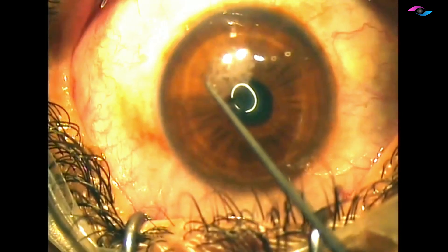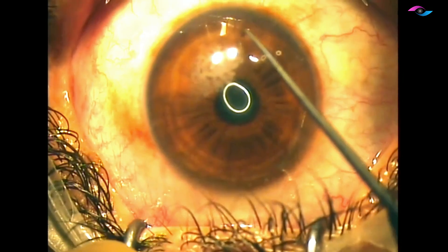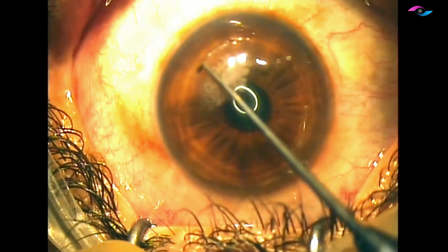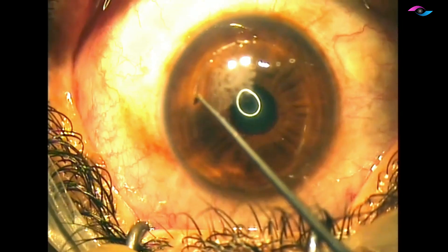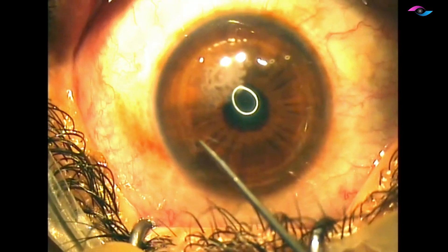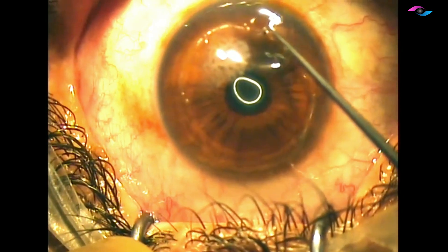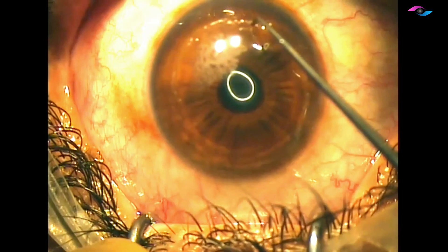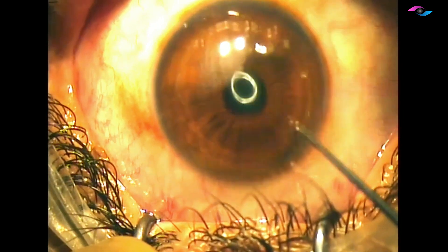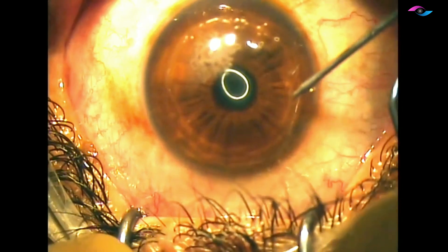We have taken him into the LASIK OR. What we are doing here is first delineating the flap which was created 15 years ago. We are making sure that we have all the flap margins, so that we don't end up tearing this old, very adherent flap.